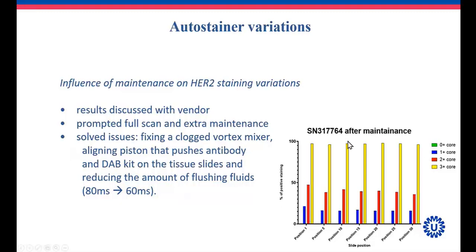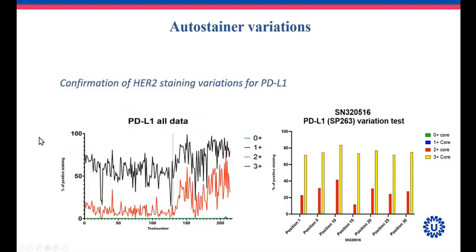And after maintenance, you see that the results were much more stable. Just look at the red bars again for the 2+, and you see that after maintenance, the results were much better than before. So that actually shows that you can detect some hidden problems within these machines by having this technology in place. Just to make sure that these results were not unique just for HER2, we decided to repeat some of the experiments for PD-L1.